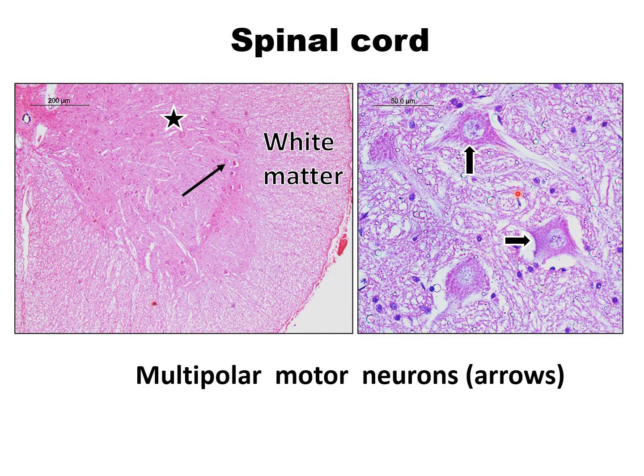And the small nuclei that are visible, these are the nuclei of the glial cells. Already you know that there are three types of glial cells: astrocytes, oligodendrocytes, and the microglial cells. And with this stain, it is not possible to identify the individual glial cells.